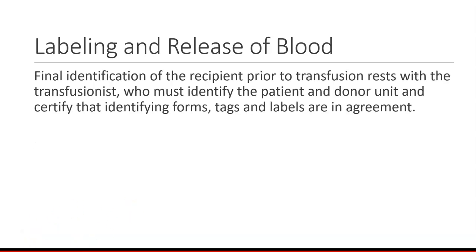Final identification of the recipient prior to transfusion rests with the transfusionist, the person who is actually going to give the component. They must identify the patient and the donor unit and certify that identifying forms, tags, and labels are in agreement.